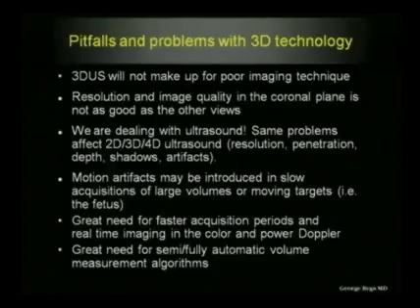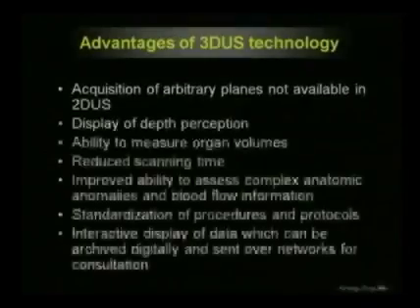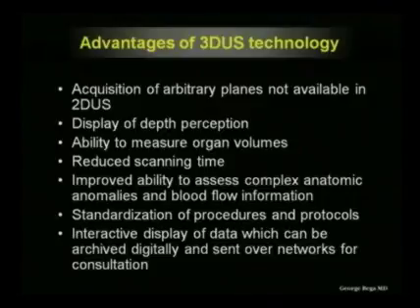So scanning in 3D ultrasound will have to be kept in mind. It would have to really be done by trained sonographers or sonologists. 3D ultrasound needs extra time and extra training. This is not something that normally an experienced 2D sonographer or sonologist can immediately pick up. You would need additional time to train yourself and additional time to understand the relationship between the planes in an interactive display. We still need faster acquisition methods and more automatic ways to acquire volumes.